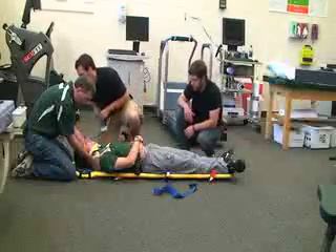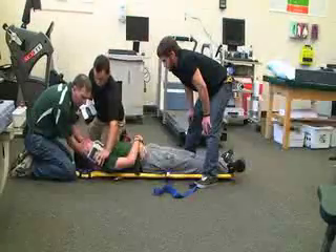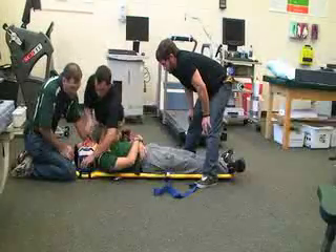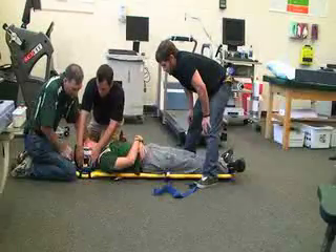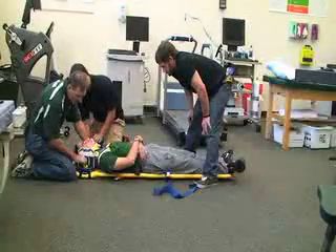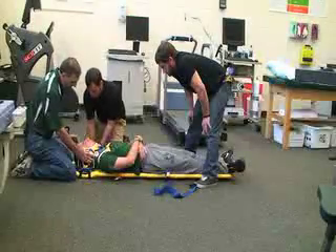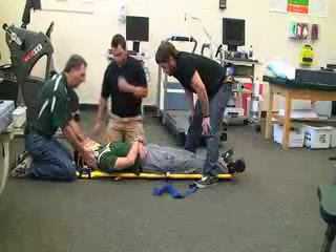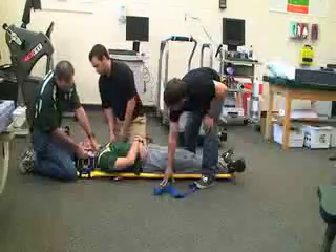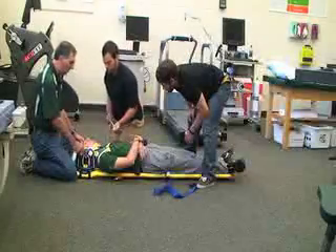Now that the cervical collar is on, I'm going to ask rescuer two to grab the two head pieces and place one on each side of the head. I'm going to move my hand as quickly as he puts it on. He can push the yellow button to adjust it up and down, and once it's in place he's going to push it down. Once that's connected, we're going to connect the straps at the head with the velcro — one that goes across the chin and one that goes across the forehead.